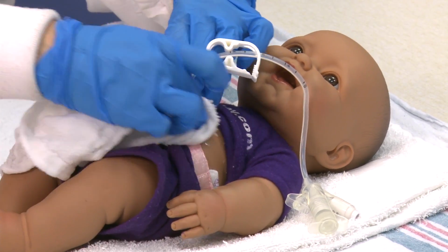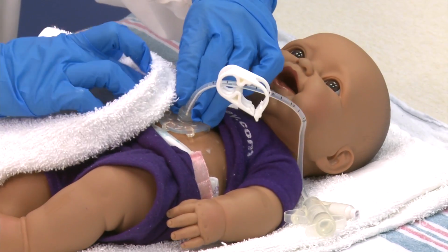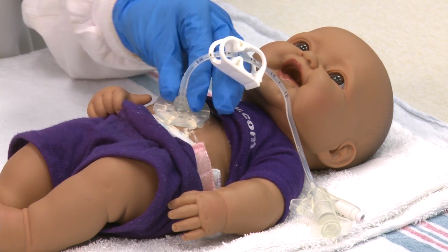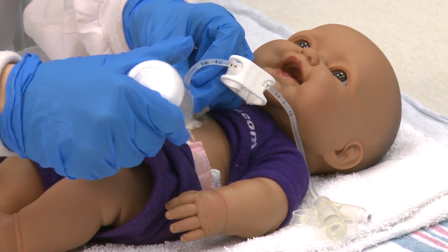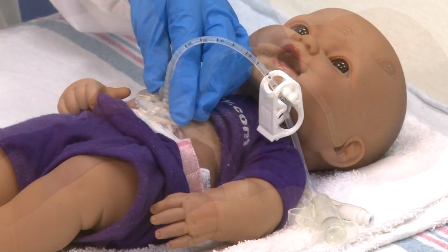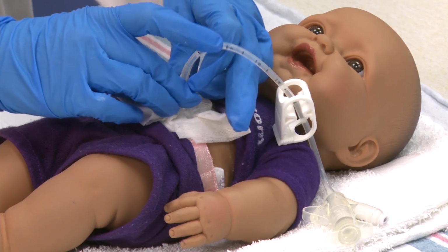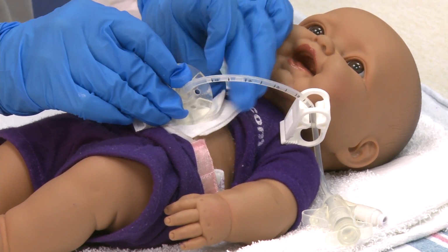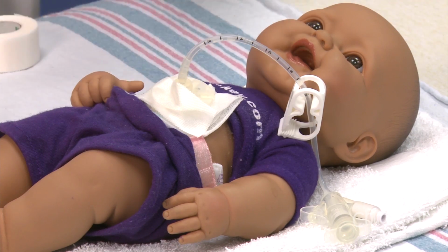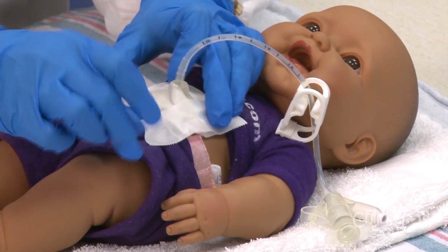Hold the tube straight up and clean the skin around the tube with warm, soapy water. Rinse the area and pat dry. Sprinkle stomahesive powder around the tube if there is lots of drainage. Place one 2x2 gauze with a split under the disc, and then place 4 pieces of tape to cover the ring, gauze, and skin. This is called H-taping.